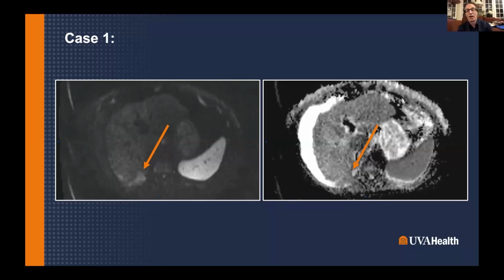We're coming up on the end of the hour, but we have a couple of last comments and questions, one of which is, for nodule enhancement that may be transiently present after treatment, are there ancillary features, such as diffusion restriction, that may help decide whether it represents post-treatment change versus viable tumor? That's a good question. Unfortunately, diffusion doesn't always help. Obviously, if the diffusion goes so it's more free water, then it helps. But like the example I showed, there aren't always ancillary features, and that's the interesting part. So it looks like it's viable tumor basically, and then, tincture of time, just by waiting, you see that it does resolve that nodule.